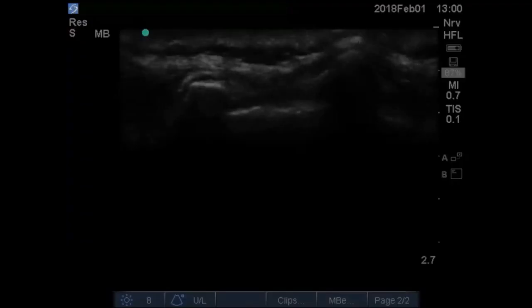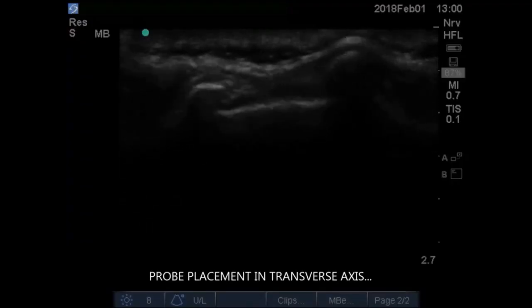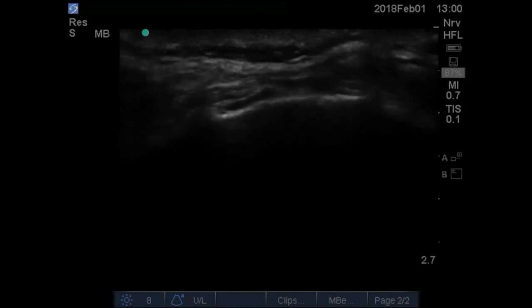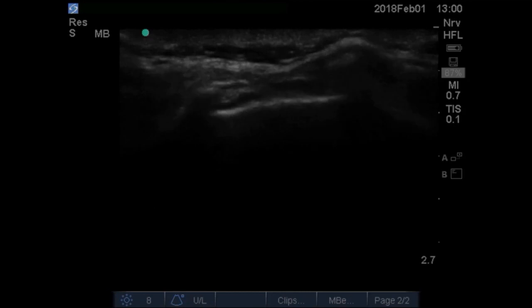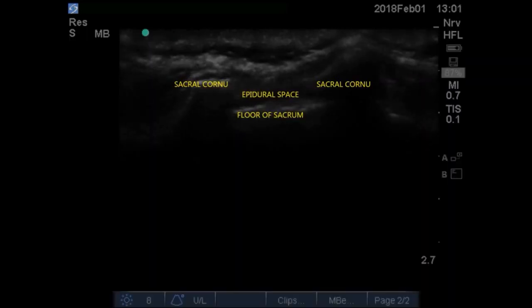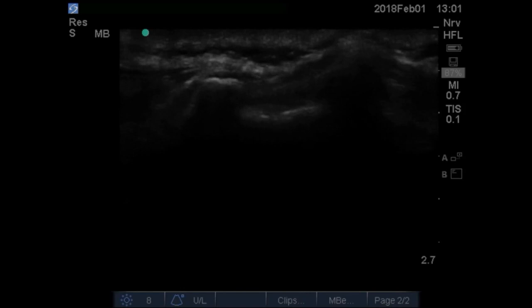Now see how I am scanning — from the coccyx to get the sacral hiatus view. In the transverse axis we identify the two sacral cornua. At this point we are nearer to the sacral cornu. Two bilateral sacral cornua and epidural space are visualized, and the floor of the sacrum is well seen. At this point we need to convert this view into the longitudinal.